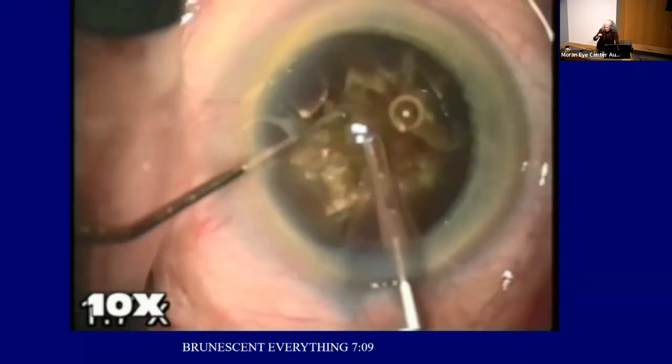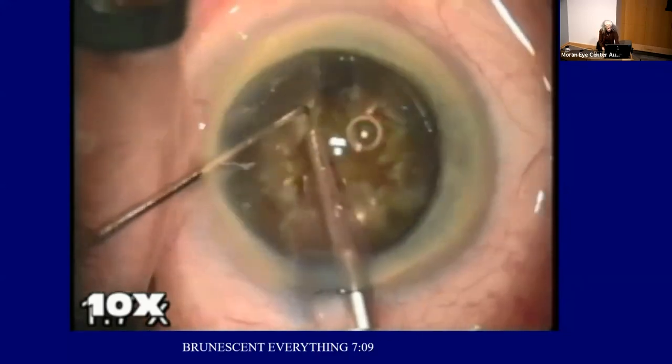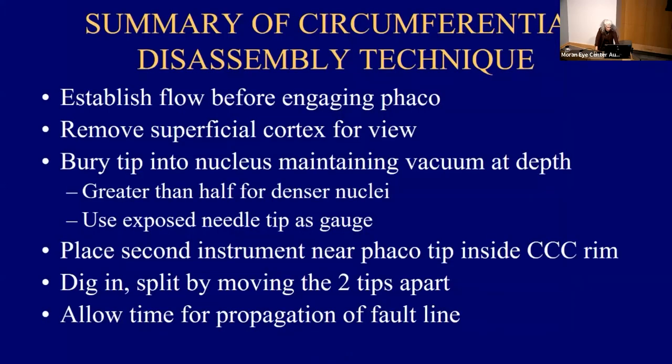Thank you. It's so zonule friendly that we don't need to hold the zonules in that colobomatous eye, and it was a very shallow eye, and still the cornea did well. So: establishing flow before engaging phaco, removing superficial cortex for a view, bury the tip into the nucleus, maintaining vacuum at depth, and then place the second instrument and dig in, allow time for propagation.